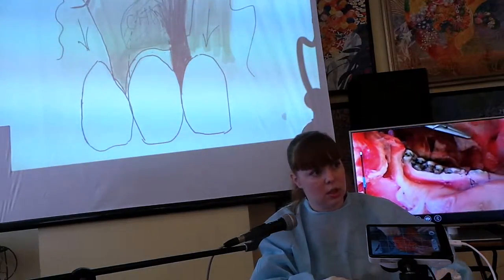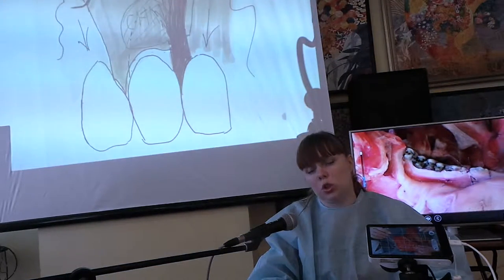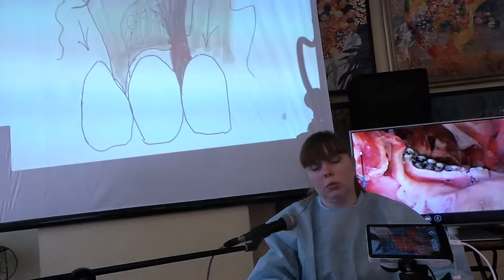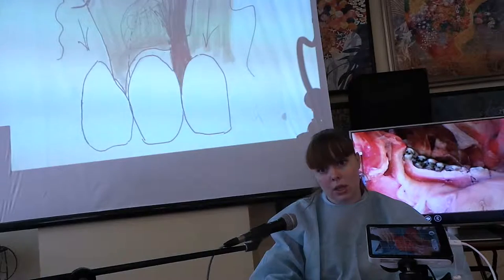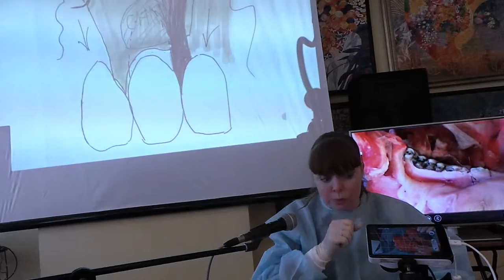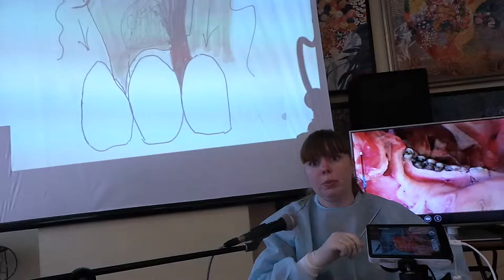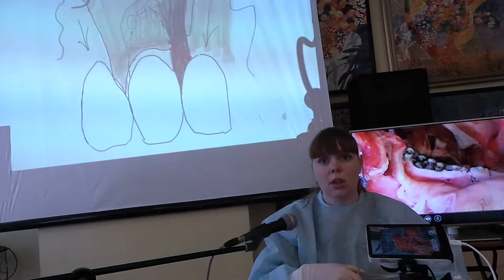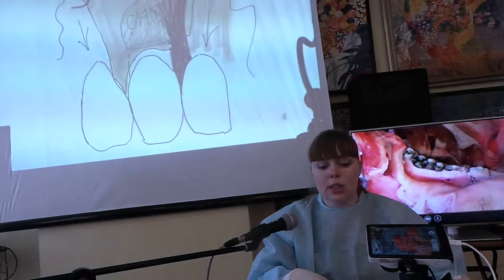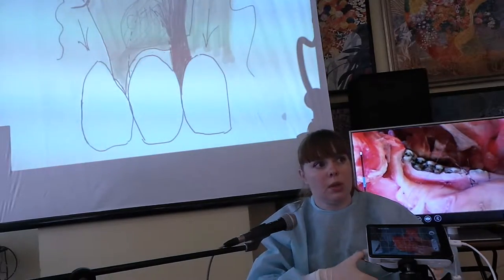Вот вы зафиксировали слизисто-надкостничный лоскут. Он будет чуть выше, потому что вы отложили глубину рецессии плюс один миллиметр от вершины анатомического сосочка. Поэтому хирургический сосочек ляжет ровно, перекрывая на один миллиметр саму глубину рецессии — коронарнее. Это на динамическое рассасывание и динамическую усадку ткани даётся зазор в один миллиметр.